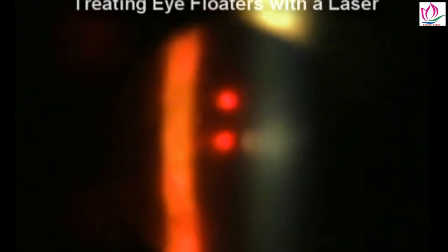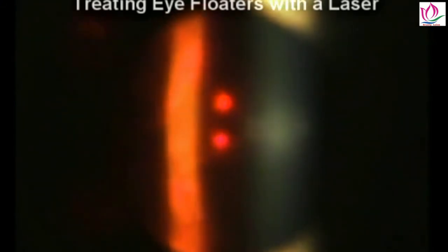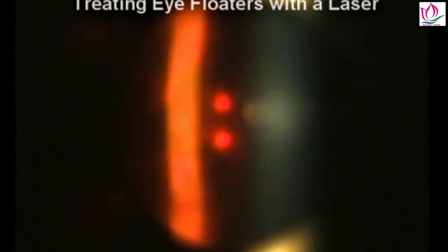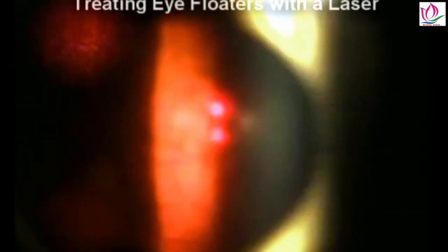And in a moment, I'm going to do a wider scan, and we're going to scan the quadrants here to show you that that floater that was there 20 or 30 minutes ago is essentially not there. This is, I think, a strong argument and good evidence against the claim that the laser just breaks the floater up into smaller pieces, and so you're left with a lot of small pieces. Well, if you look around here, as I'm doing with this lens, scanning back and forth in all the different quadrants of that sphere, that ring is just not there. That floater material is just not there.